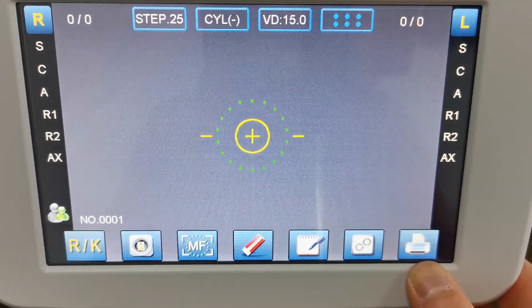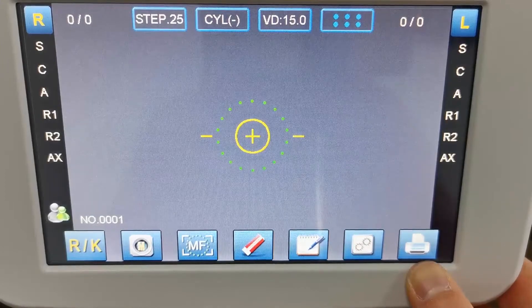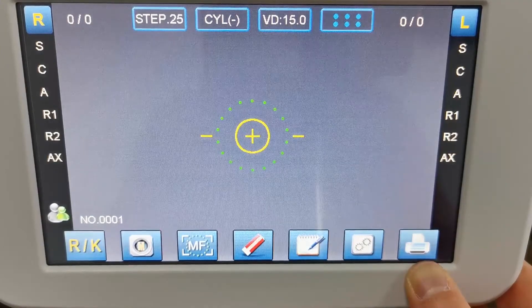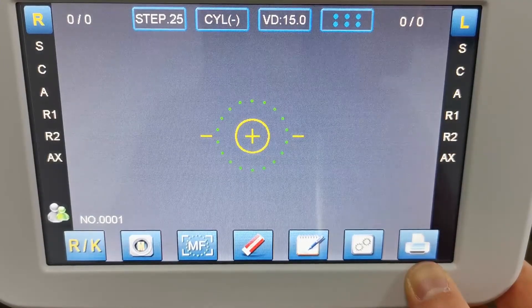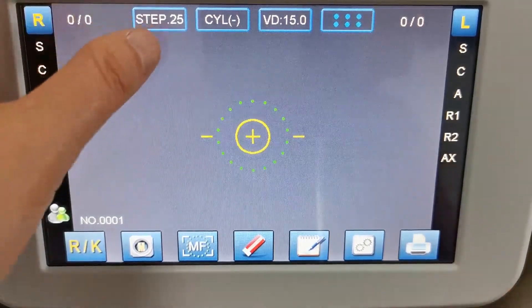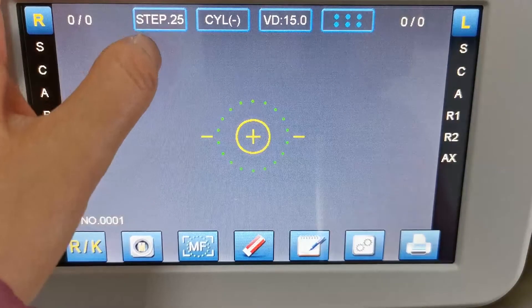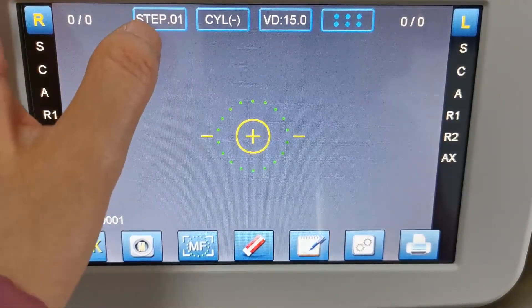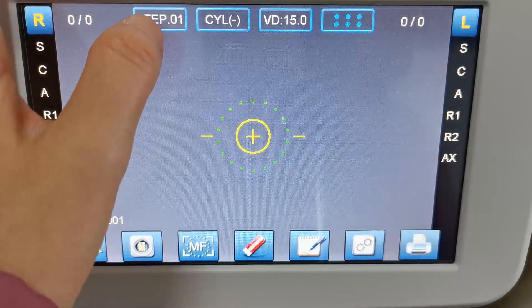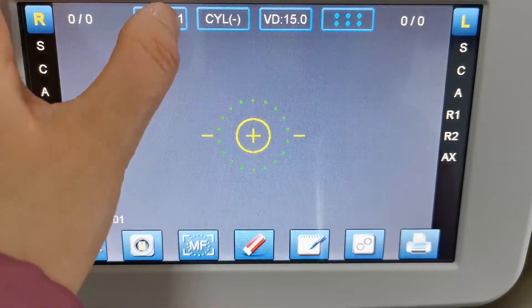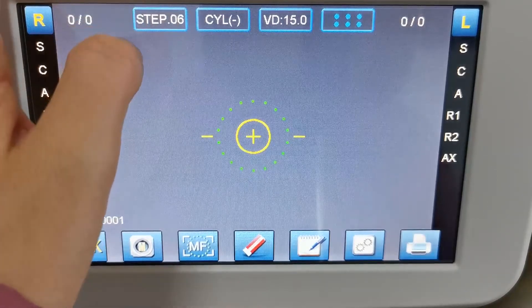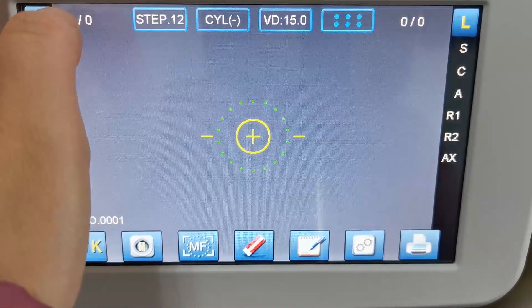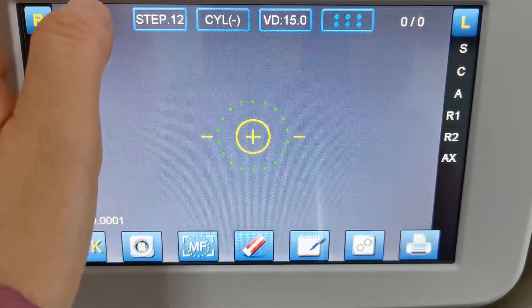Here is the printer icon to print the measuring records. And here you can change the step between 0.01, 0.06, 0.12, and so on.